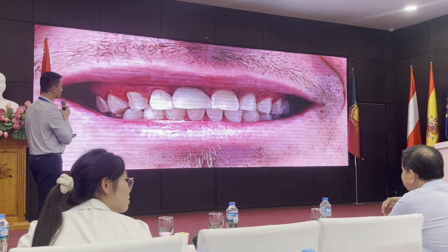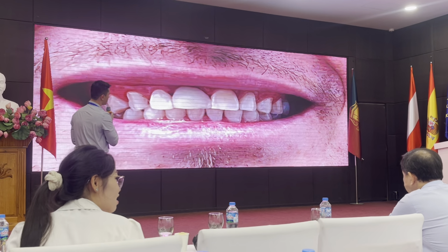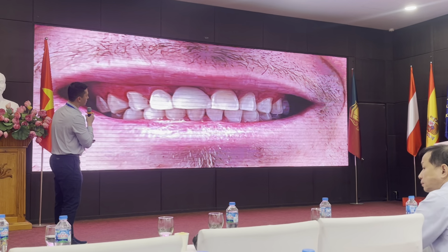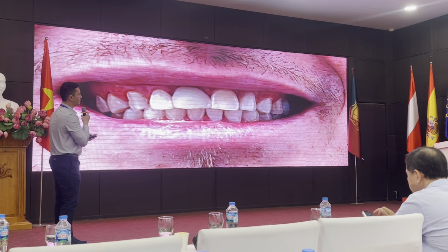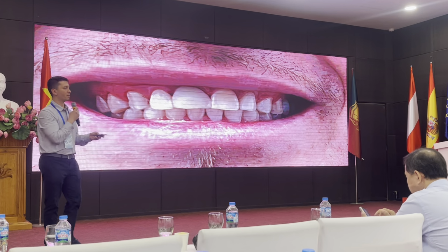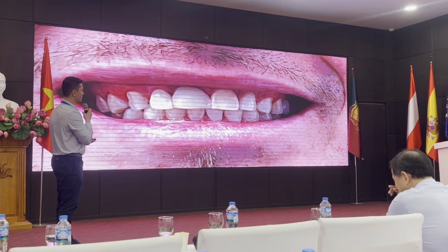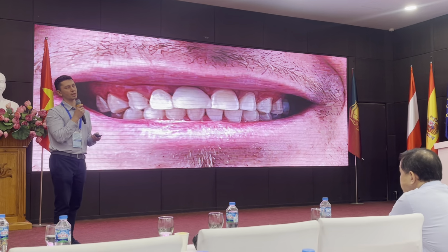So occlusion is also important here, because I don't want patients to function on that front tooth. So even though I reduce the lingual occlusal contact here, when he's biting eccentric, he's going to eventually forget that he has an implant there and accidentally bite on his front implant tooth. So to some extent, there's really not much I can do.